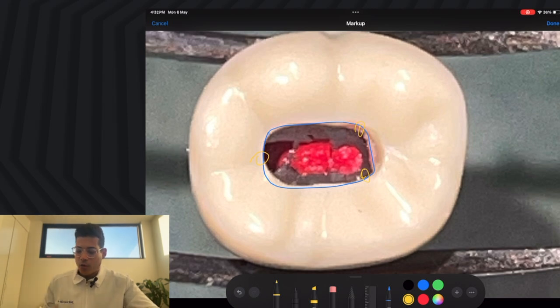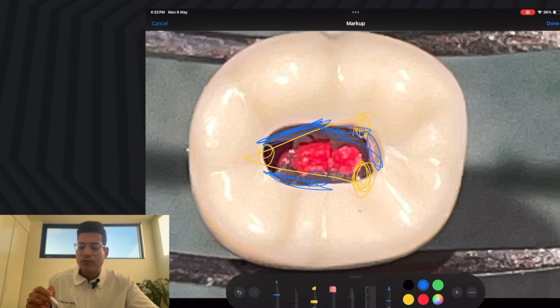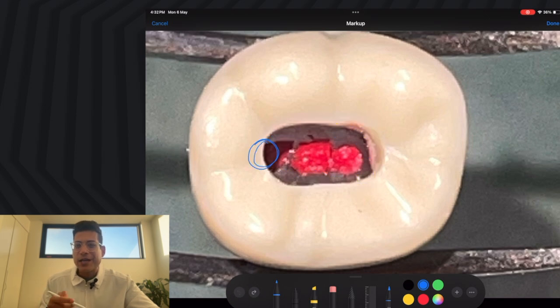And you'll notice they've opened extensively on here, which is your red, or I'll mark it as something else color like blue. So they marked this, they thought this was the canal opening. And what happened? All that is their excess. Remove too much. And worst bit is the distal still has a shadow. That means they have not removed it. So that's roof present there.